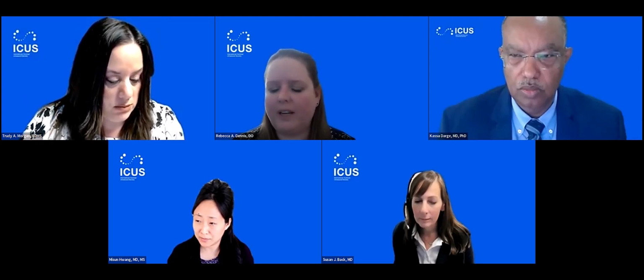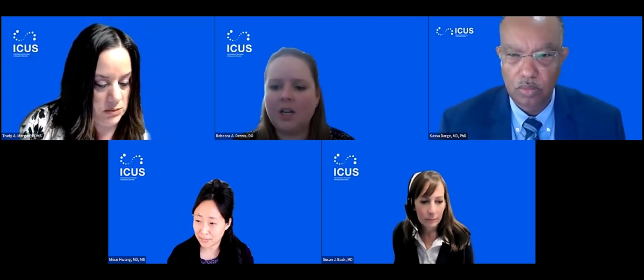And then if it's a follow-up or something that was incidentally seen on other imaging, maybe look and see, is there a lesion that already looked concerning? And go from there. That's also where, with so many liver lesions, it's helpful to maybe do a first test injection to scan throughout the liver and see if there's something that's early washing out. Then you're like, okay, well, now we'll do a second injection and focus on that one.